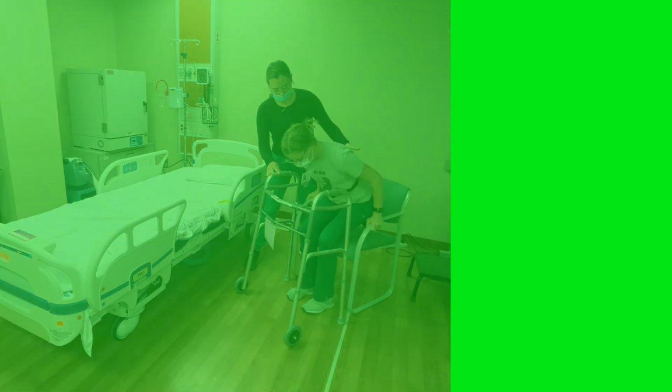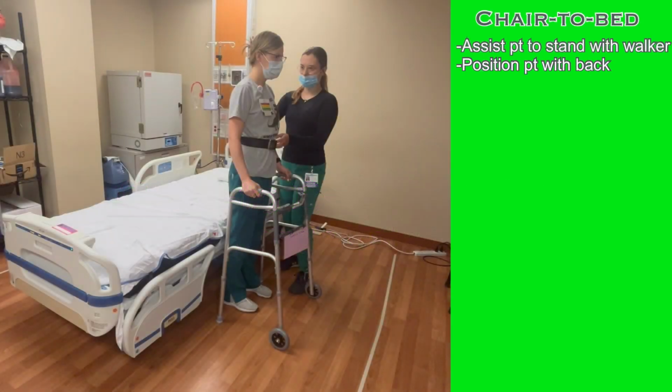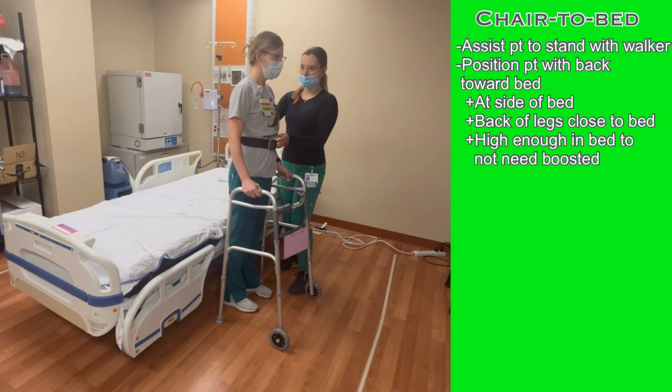When you need to get a minimum assist patient back into bed, first, utilize the previously demonstrated techniques for assisting a patient up with a walker and guiding them into position with the walker and gait belt. The patient needs to be in position at the side of the bed, with their back to the bed. You will help the patient to sit in the bed with a similar technique to sitting in the chair, but before you have the patient sit, make sure you won't need to boost them up after they lay down by having them sit down closer to the head of the bed.